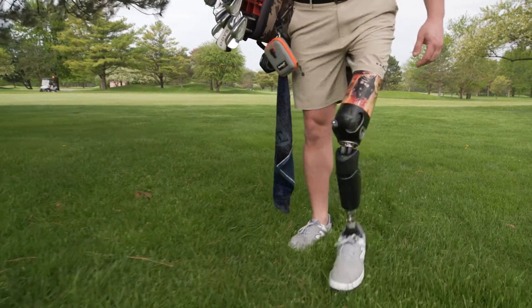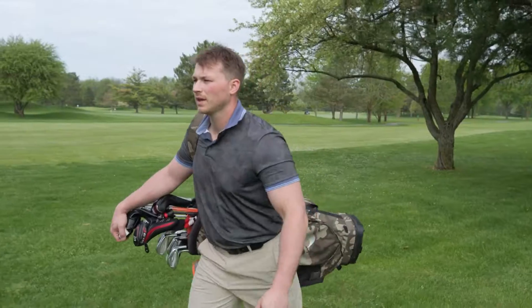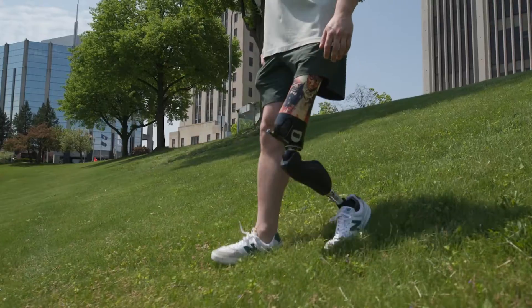Walking up and down different terrains on the golf course is what I really love about it. If you're going on a decline, you can really just ride the knee down and don't even have to think about it — it's always going to be there.